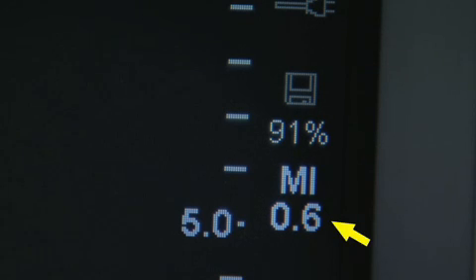Image symbols indicate the storage type and the amount of internal storage remaining. A continuous reading of the mechanical index, or MI value, is provided.